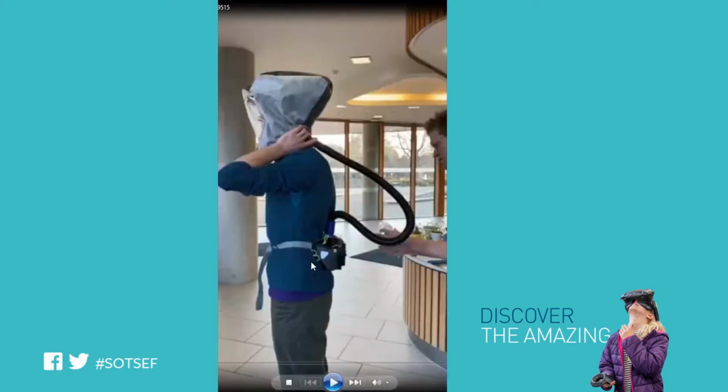So we carried out a series of proof of concept tests instead of the full set of regulatory tests that you have to carry out to be able to sell devices like this. We've got a variety of them. We have a photo of one of them: with the respirator masks, we need to demonstrate that they fit appropriately. So there's a spray test, and this is me, indeed in the same T-shirt.